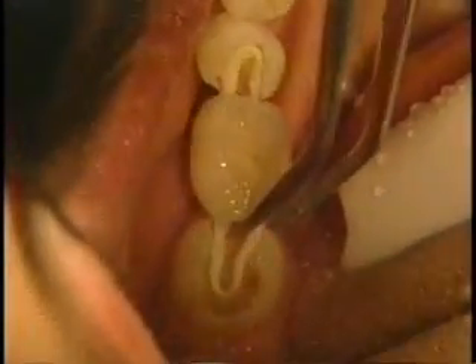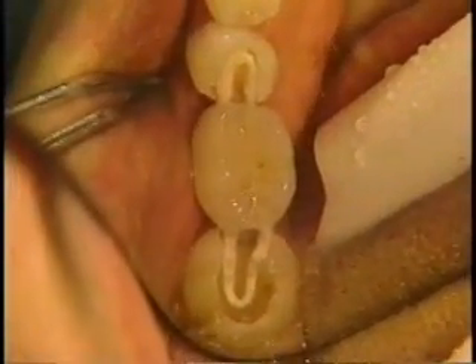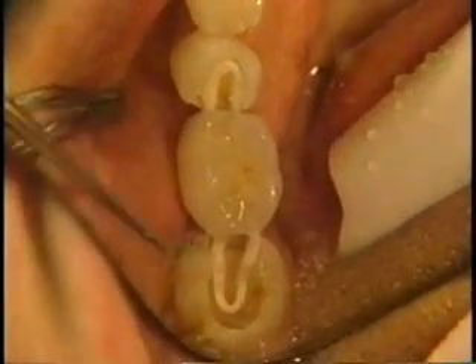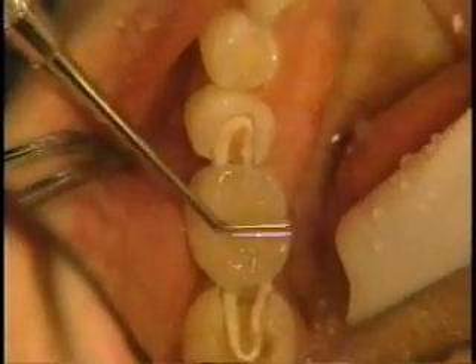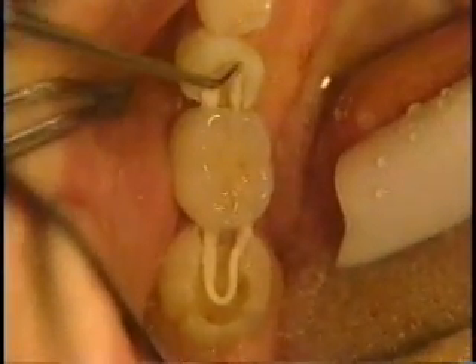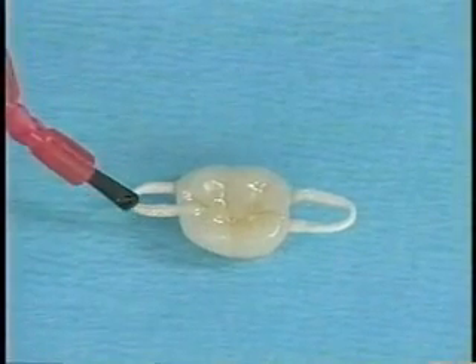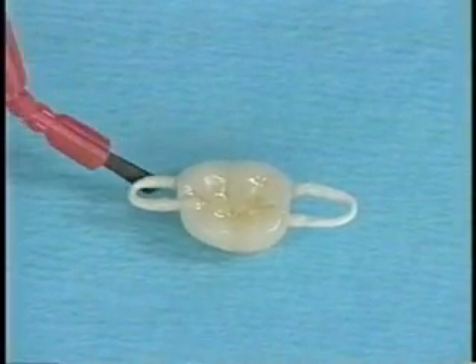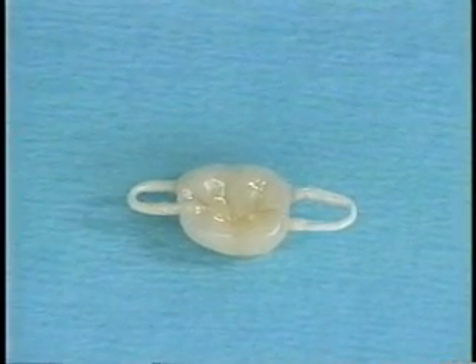Try in the glassband bridge for proper fit and confirm that tooth preparation is adequate. Make adjustments as required. Be sure that the channels permit the glassband to fit below the occlusal surfaces of the abutment teeth. Coat the flexible glassband attachments of the bridge with clear bond and porcelain veneer luting paste or a flowable hybrid composite resin.